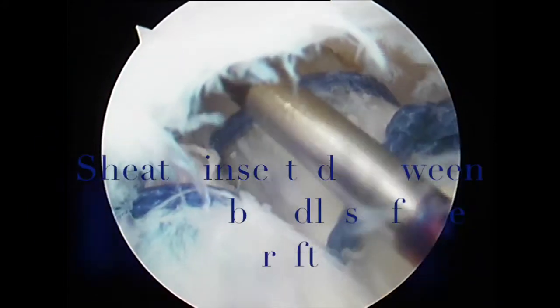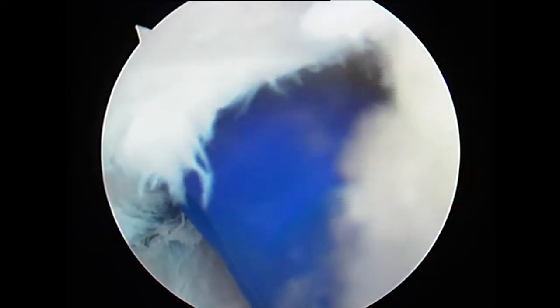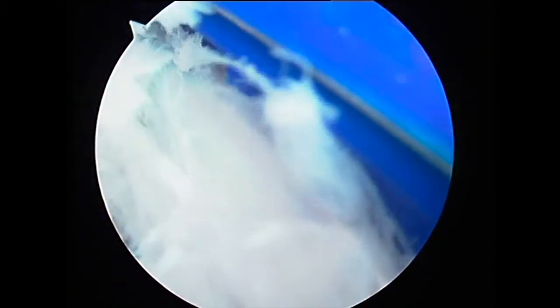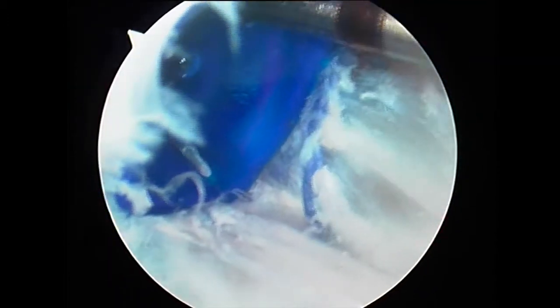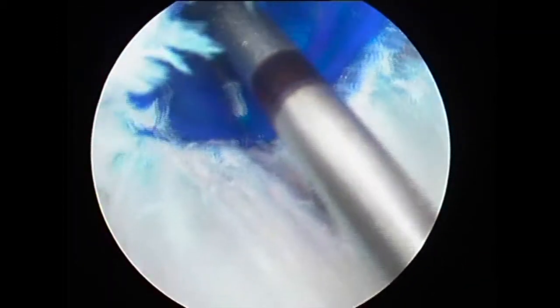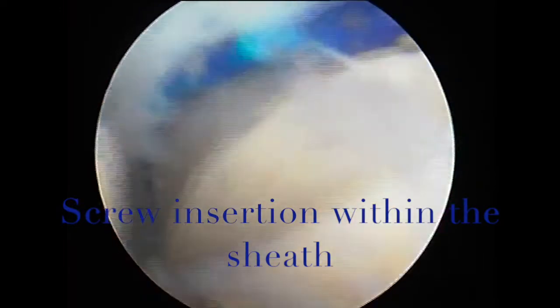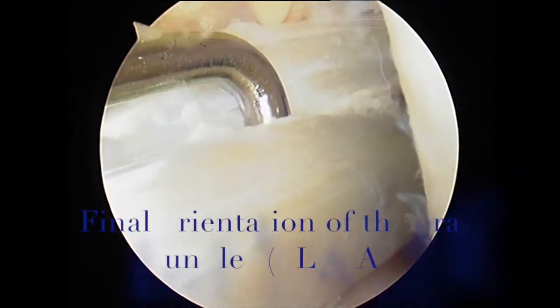The sheath dilator has been removed and the sheath itself is inserted — it is triangular in shape, with the base of the triangle directed anteriorly, and the acute angle is driven between the two bundles of the graft. A screw is then inserted within the sheath and compresses the ACL graft against the walls of the femoral tunnel. This is the final orientation of the ACL graft.